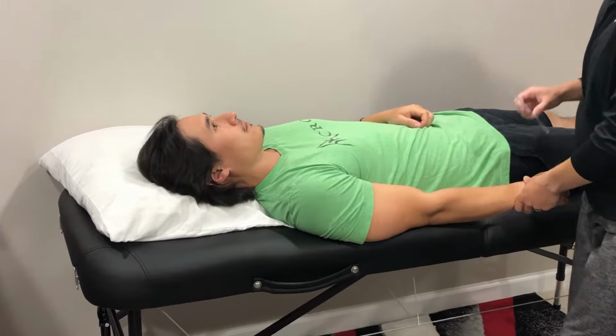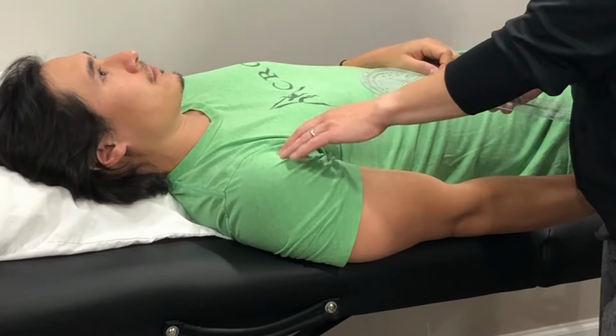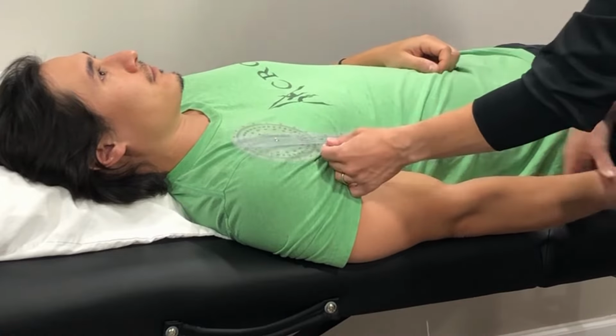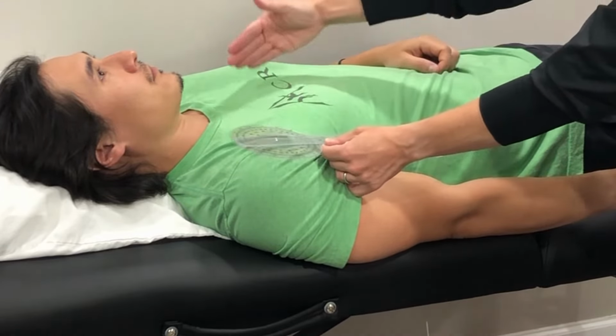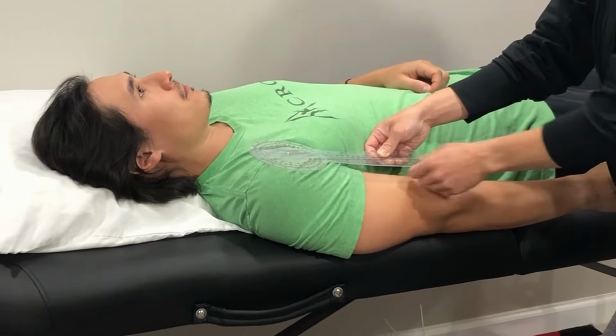Measuring active range of motion. I'm going to line the fulcrum of the goniometer up with the anterior aspect of the acromion process. Align the stationary arm parallel to the sternum. And I'm going to align the moving arm up with the midline of the humerus.